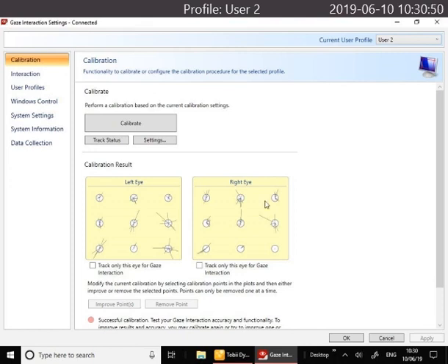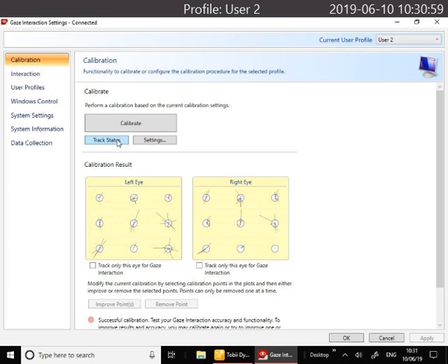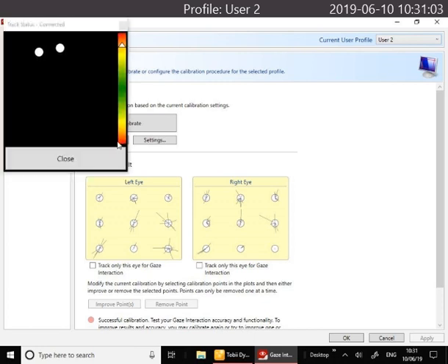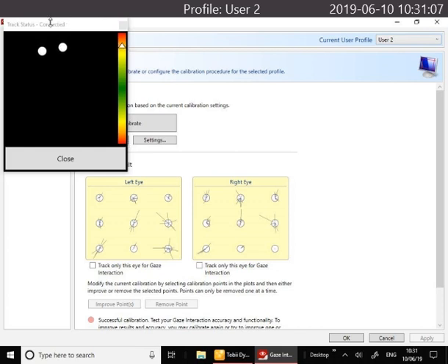The first thing you need to do is set the position. You can do this by going to the Track Status icon here, or you could also press the top button on the left hand side of the device, and this will also bring up the box.